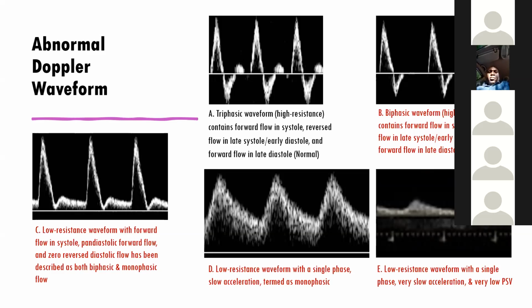Sometimes the surgeon will just dilate the stenotic part to allow the blood to flow through it, or sometimes the surgeon needs to amputate the limb, so he or she needs to know up to which part of the limb blood flow is better. That's why you have to identify the stenotic part of the blood vessel or the artery. So when you get an abnormal spectrum, then you will understand there is a stenosis, so you should go up.